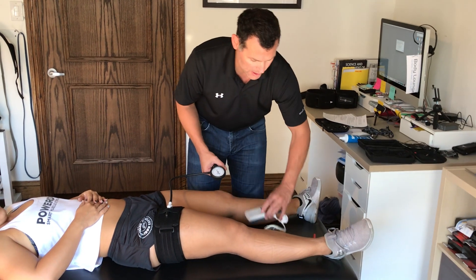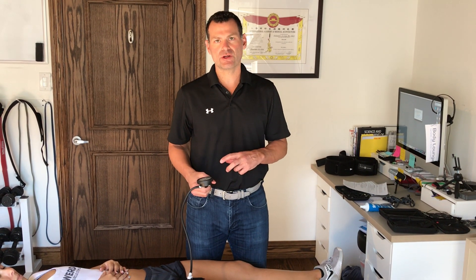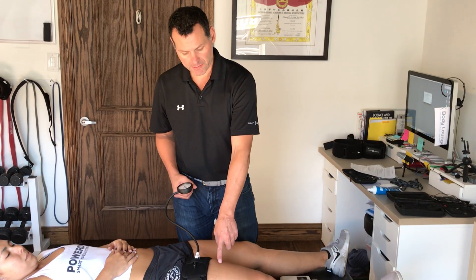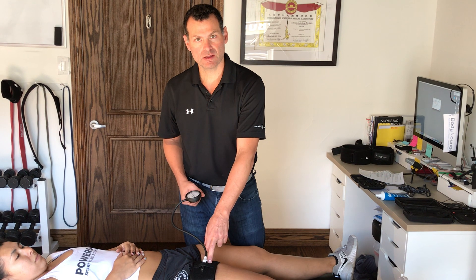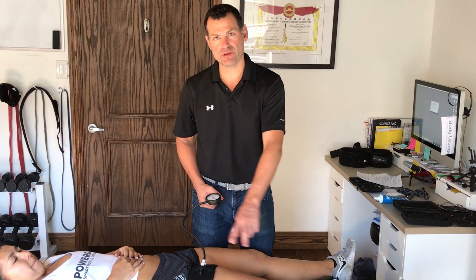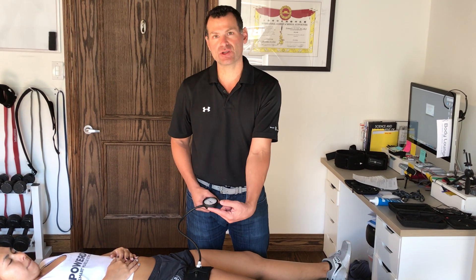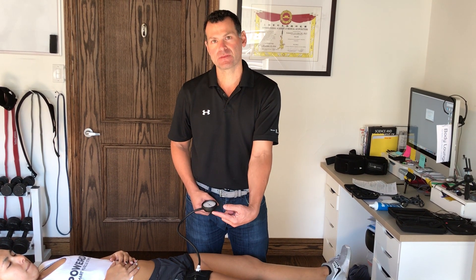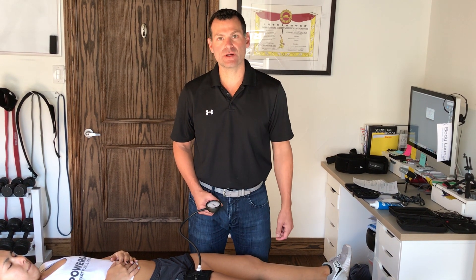So that's what's telling me: 140 millimeters of mercury on this limb, in this position, with this cuff, is causing limb occlusion — meaning she's not getting any arterial flow into the leg and she's not getting any venous return back to her heart. And that's how we find limb occlusion pressure in the lower extremity.